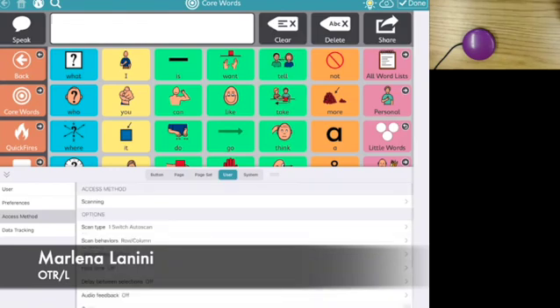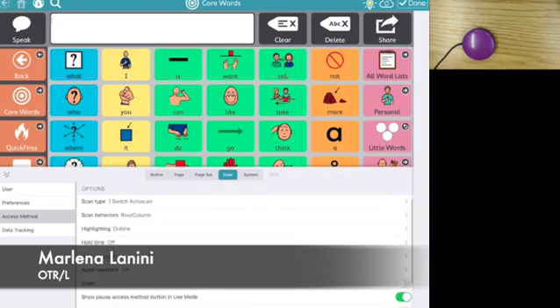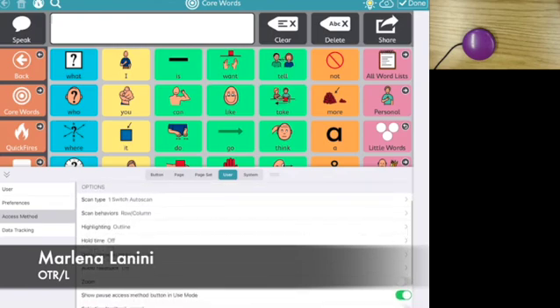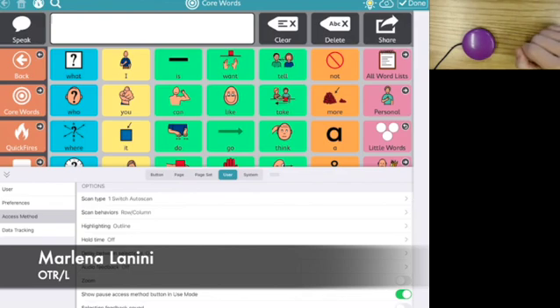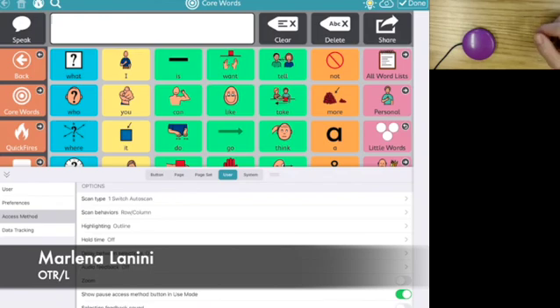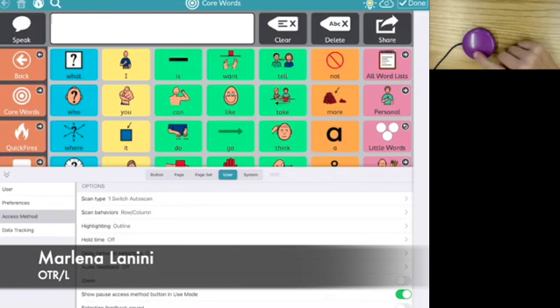When I did that, it opened up this whole menu for switch scanning, so I can change the behavior of what this one switch does, or I can even add a second switch. I can speed it up and slow it down and customize it so it's really fast and accurate for someone to be able to use switches to control this communication device.